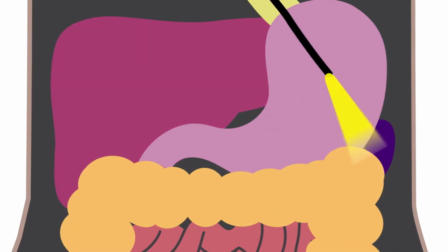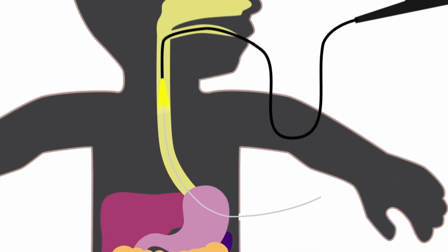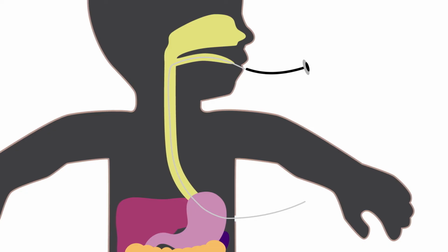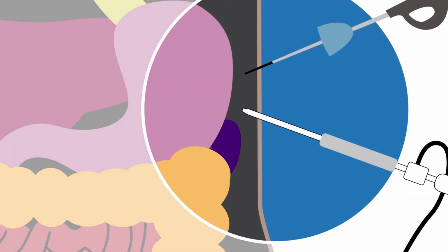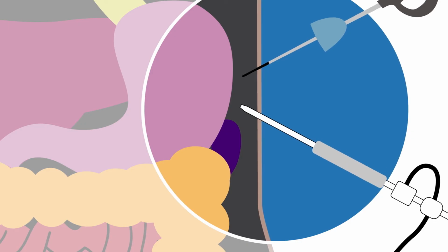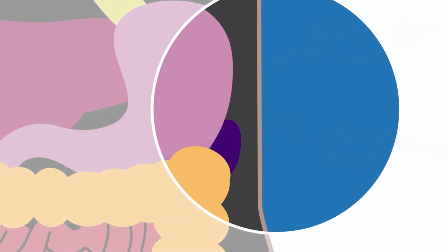Once the correct place is located, the doctor will make a very small cut on the skin. This allows for a thin metal thread to be used to pull the G-tube through the mouth and out of the stomach. The end of the G-tube has a soft bumper on it, which will keep the tube from being pulled out. A stabilizer on the skin side of the tube will help keep it in place. If the doctors can't find a safe place for the tube with the endoscopy camera, they may decide to place a G-tube a different way with the use of laparoscopic cameras or through open surgery.